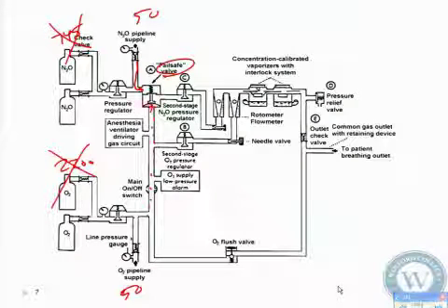But this is a closed diaphragm. So as it presses up with pressure, it's going to cause this to rise. As this rises, this area in between here, this is your height here, this area is all going to be raised. So this diaphragm now will be up here. And this portion is going to be up here. And it's going to allow nitrous to flow through here.